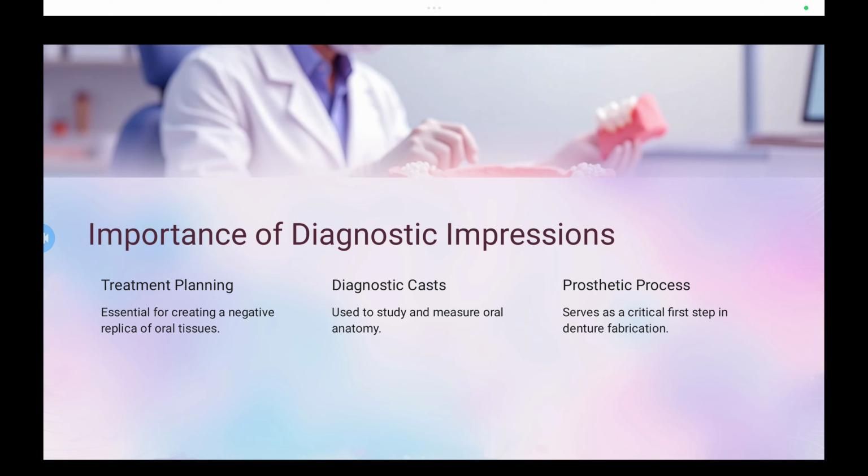Now, importance of diagnostic impressions. Diagnostic impressions involve treatment planning, which is essential for creating a negative replica of oral tissues for examining the patient's oral cavity. Next is the diagnostic cast. It is used to study and measure the oral anatomy of the oral cavity. Prosthetic process serves as a critical first step in denture fabrication.